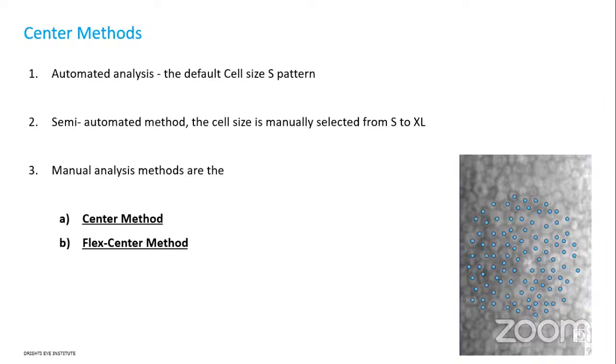Also, the machine has those different modes of capturing in six different gazes. You can have the central, and then the supranasal, supratemporal, and then inferonasal, inferotemporal, and then superior and inferior. So when do we get to use those? How would one utilize those?